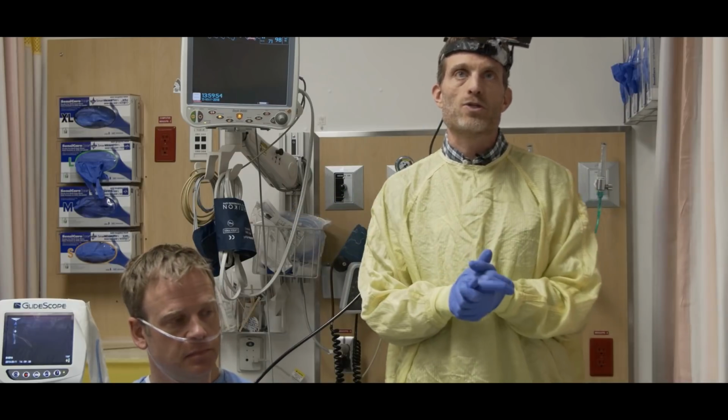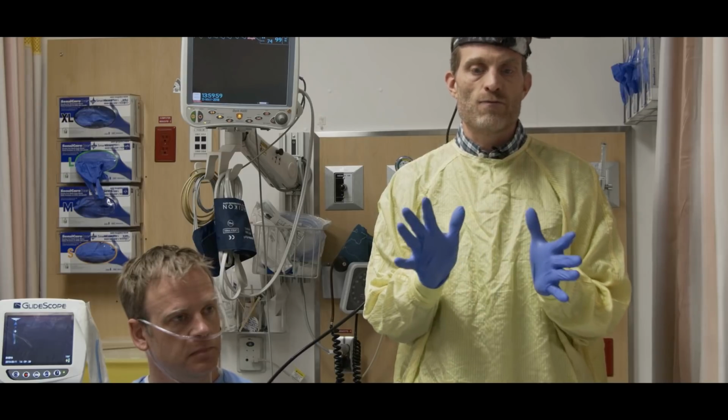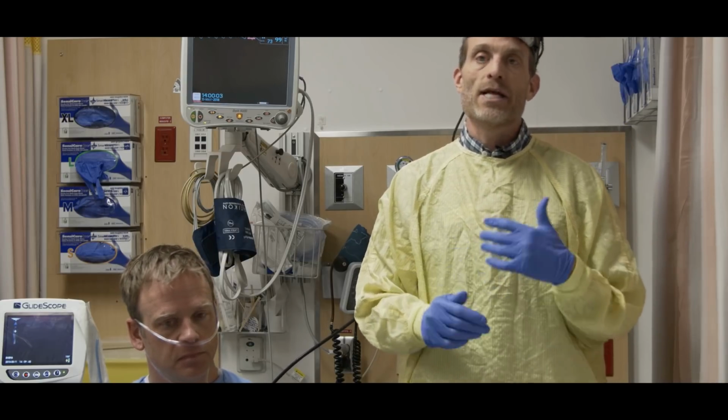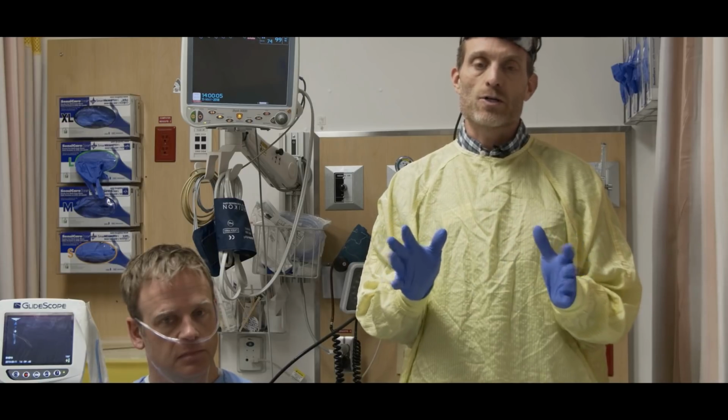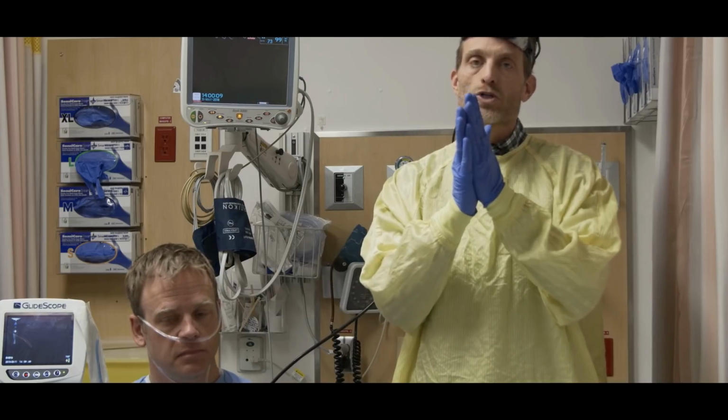A large risk with this procedure, and it's very, very small, is laryngospasm. Anytime anything directly stimulates the glottis, and when I say glottis, we mean the cords and the opening between the cords, you can have the chance that the cords will close shut. That's laryngospasm. So you do want to prepare for that. Leanne had RSI drugs ready to go in the event that we encountered that.